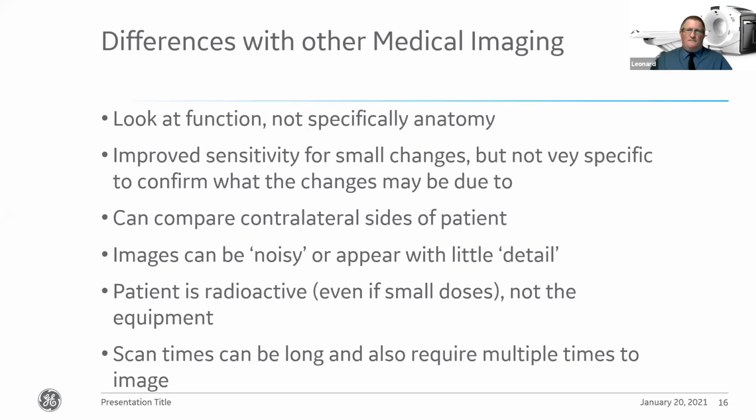The main reason that's a benefit is because even though we've got a very, very sensitive system for picking up changes within the body, the actual mechanism we've got to look at this means we don't know exactly what is causing that problem or that increase in the activity, or in some cases decreases. So it's not a very specific imaging methodology at all. As I say, the scan times can be quite long, so we sometimes require multiple times to actually image these patients, depending on what you're looking at.